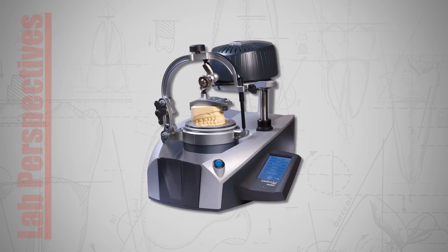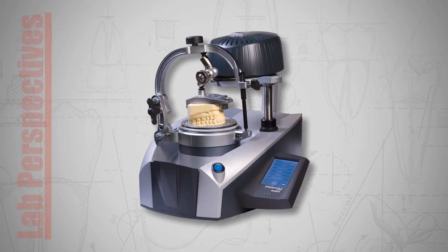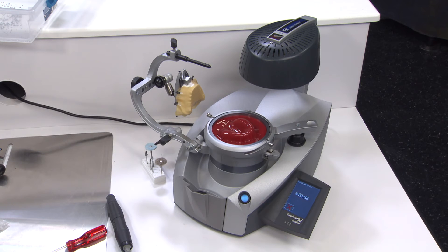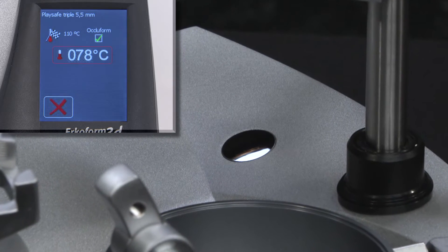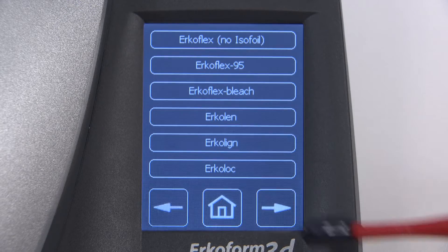The ERCOFORM 3D Motion is the newest iteration in the popular ERCODENT thermoforming line that streamlines the fabrication of thermoformed appliances for increased efficiency. This automated countertop unit is designed to expedite the process with its touchless temperature control, a reserved vacuum, and pre-programmed settings.